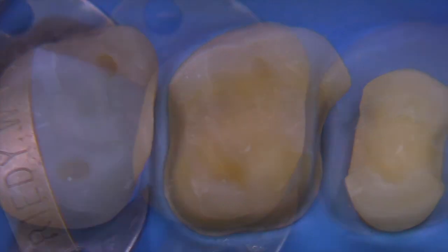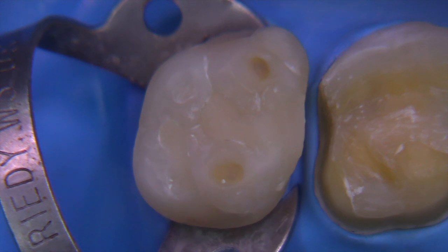So today we've got a natural tooth mounted in the typodont, and you can see that there's been a considerable amount of wear and the tooth has been patched in many places with composite on the mesial, buccal, and lingual.